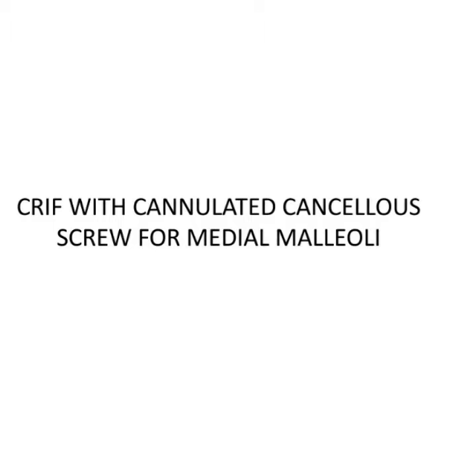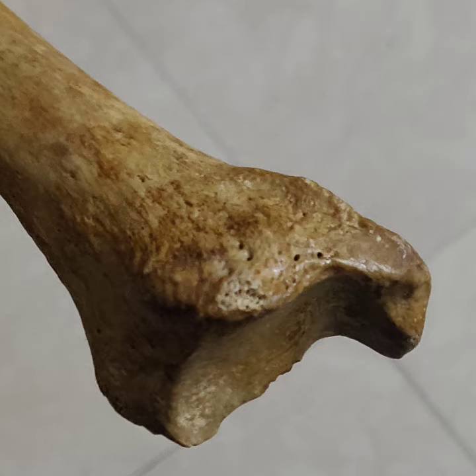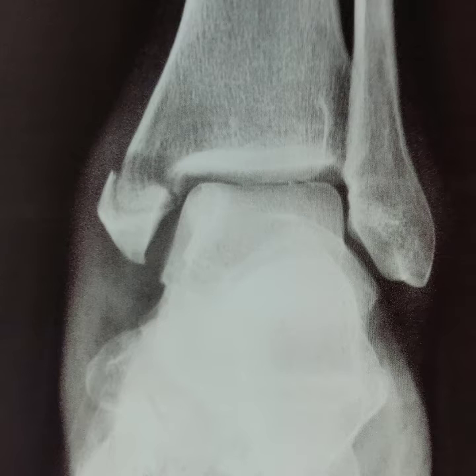Isolated medial malleolus fracture treated by closed reduction internal fixation with cannulated cancellous screws. The ankle joint being relatively subcutaneous, the soft tissue envelope around it is of paramount importance.